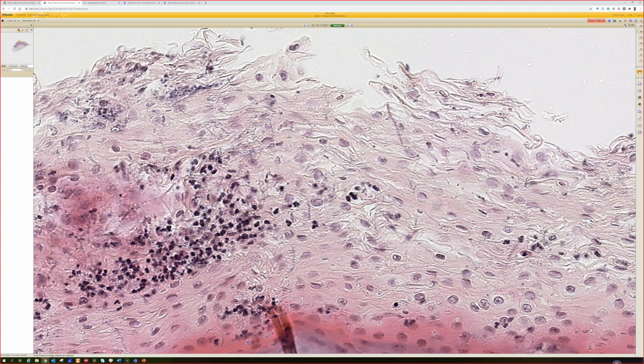So then, Candida and Malassezia, Tinea versicolor. To me, the biggest distinction is where are we on the body? If we're on the vulva or the lip and I see hyphae or pseudohyphae plus yeast and they're bluish purple, then it's going to be Candida, right? If we're on like the mid back or the chest, dry skin, then it's almost certainly not going to be Candida. It's going to be Tinea versicolor.